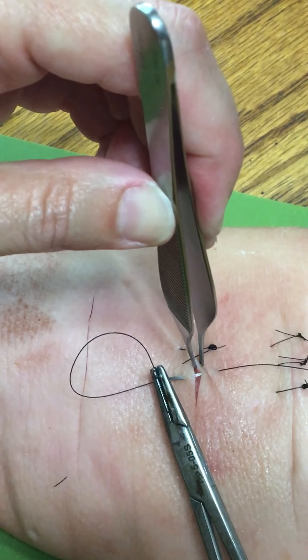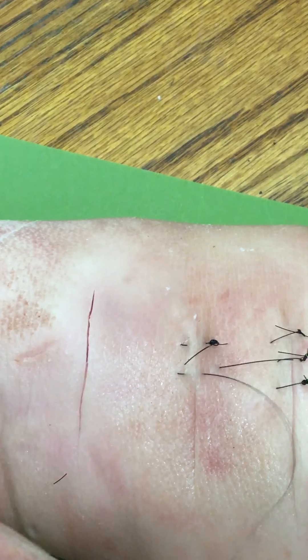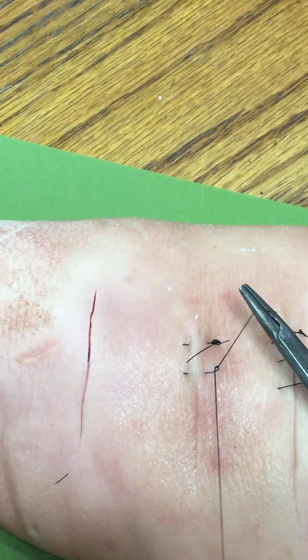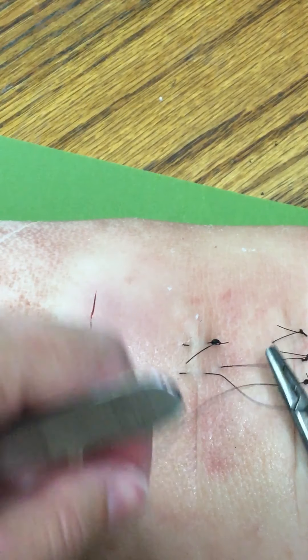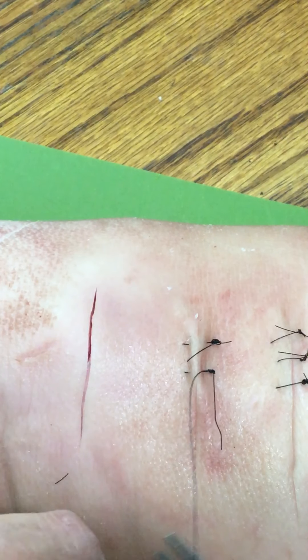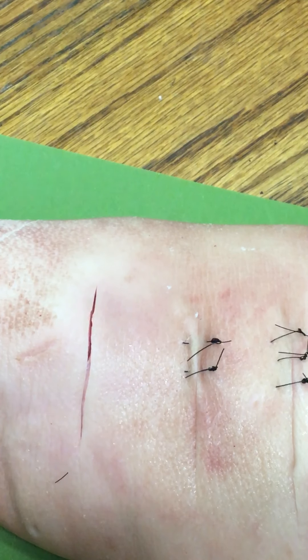I'm going to go half that distance and throw two loops. One, two. You can see as I pull that tighter, it everts the edges a little bit. By evert, it turns them out toward each other, rather than having an overlapping edge, which can sometimes happen with a single stitch.